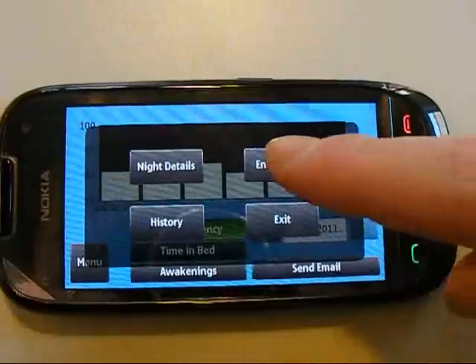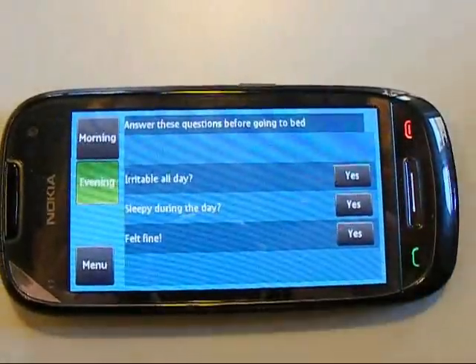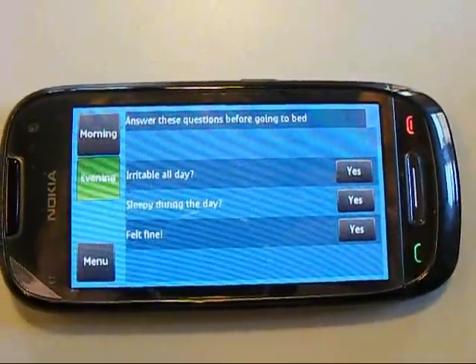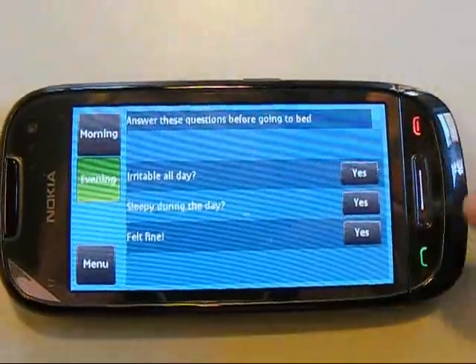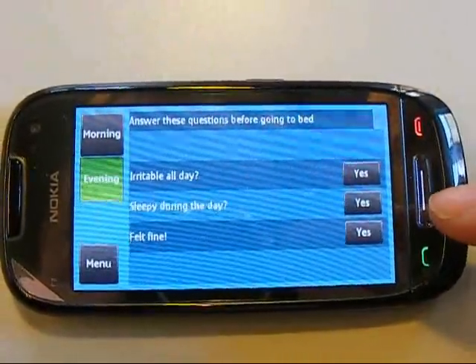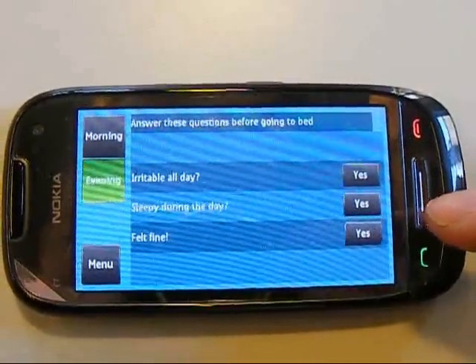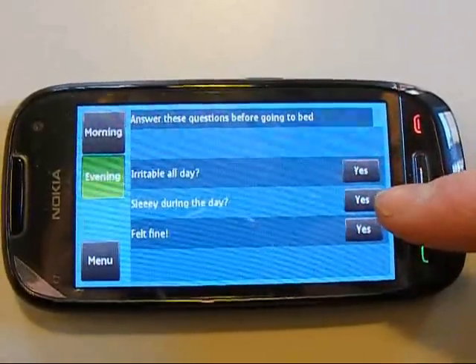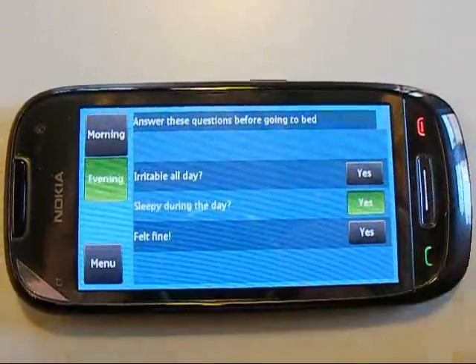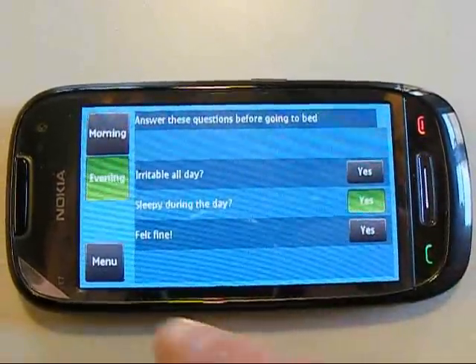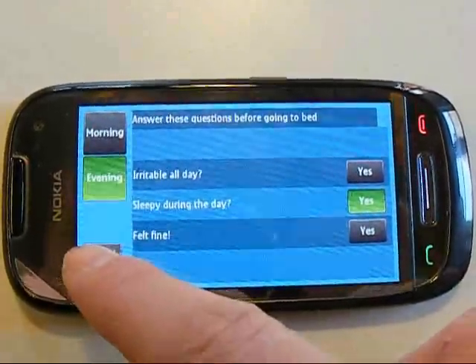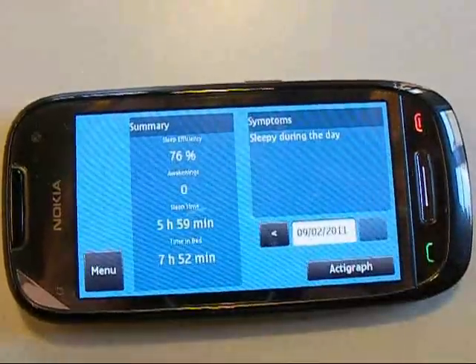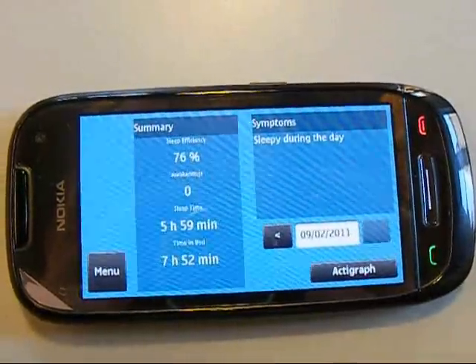There is functionality for entering diary questions for the day. If, for example, you were sleeping during the day, you enter that there and you can see it on the night details.